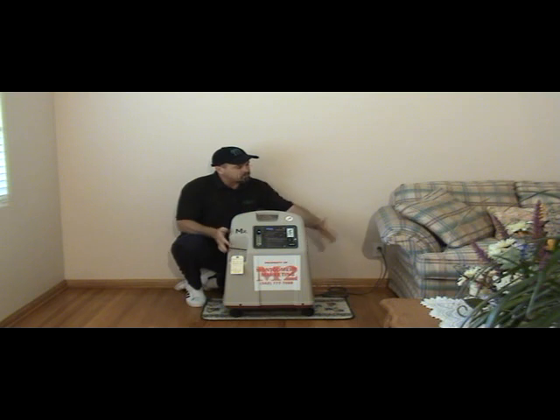So now we've got it set. We're in a good position here in relation to the patient. We've got it set on a rug underneath to eliminate some of the noise. You need to make sure you have at least 3 inches of room all the way around the concentrator. As we have here, this is a good setting.